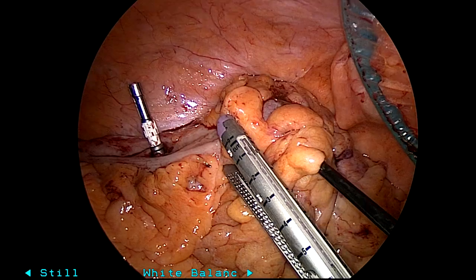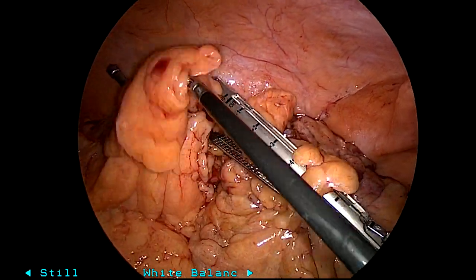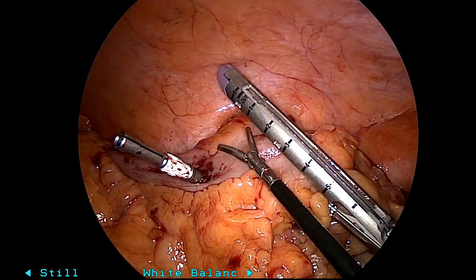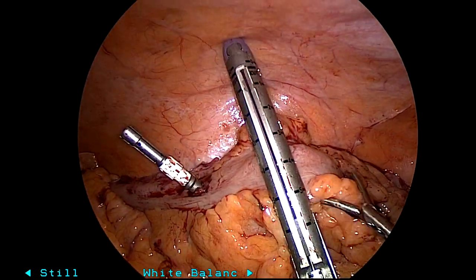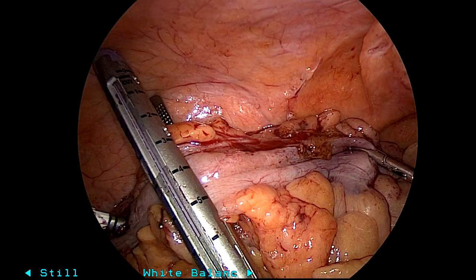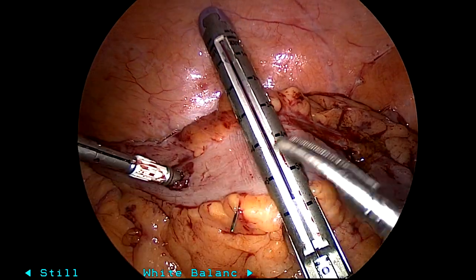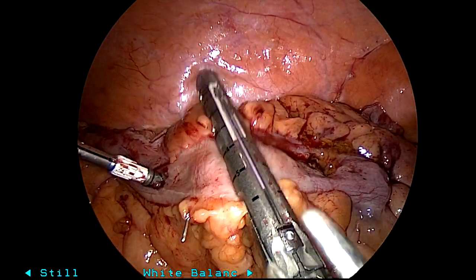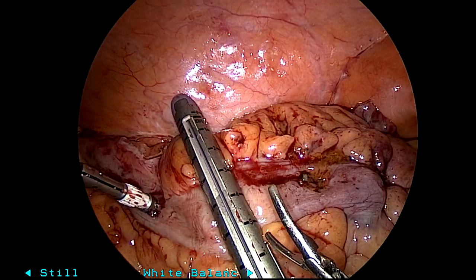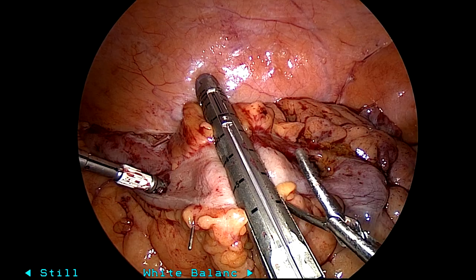Now we'll go ahead and divide. I was not able to use ICG in this case due to technical difficulties with the machine, but color change showed that this was more than adequate. I have a clip to the left of my stapler where there was pulsatile blood flow on a little poor man's cold knife cut test. So now I'm going to go ahead and divide the specimen — that's the proximal margin.